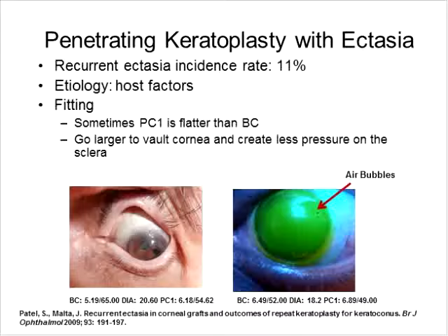When fitting a patient with a very steep cornea, as in this case, you may need to increase the lens diameter significantly in order to vault the cornea and land on the sclera without impingement. In this case, the lens diameter is 20.6 millimeters.